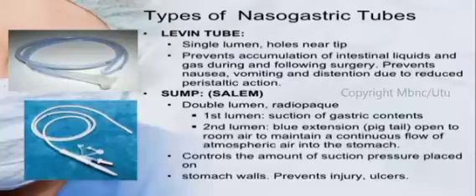Flow of atmospheric air into the stomach. Control the amount of suction pressure placed on the stomach wall, which prevents injury and ulcer.